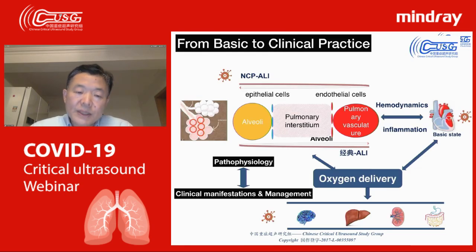Image or the pathology just gives you some ideas about the damage, how deep and how severe it is. But if you integrate this information with the other information you gathered from your patients or from your team, you see what happened, what the relationship is between the pathology, the image, and the disease, or how severe the disease is.